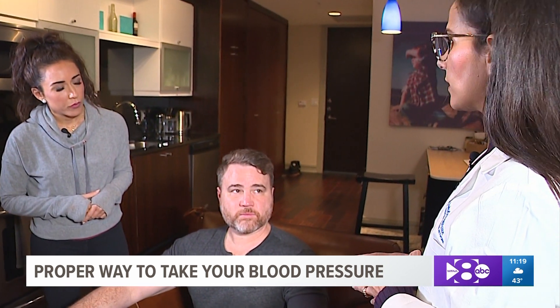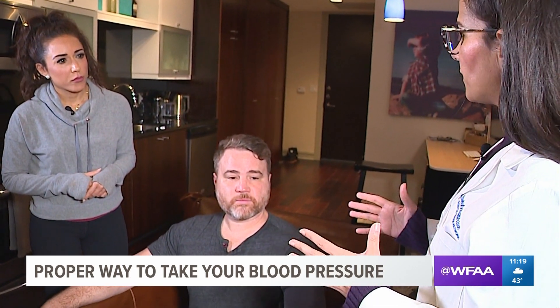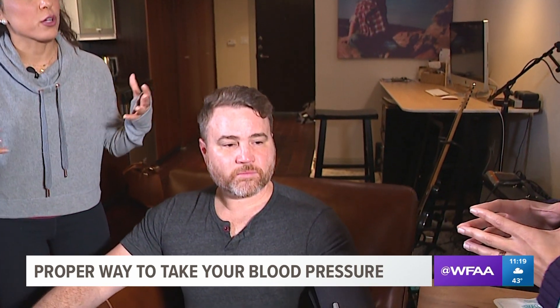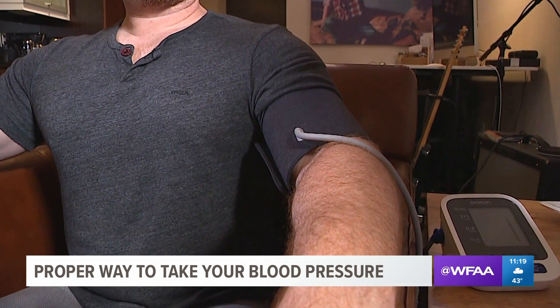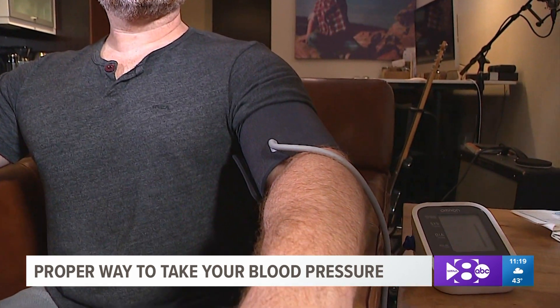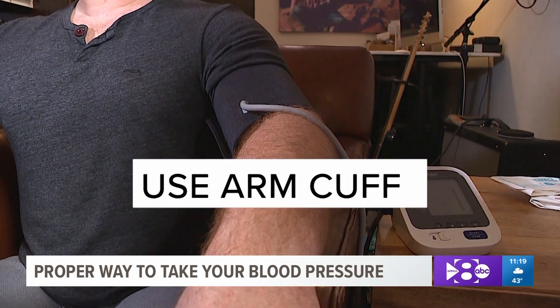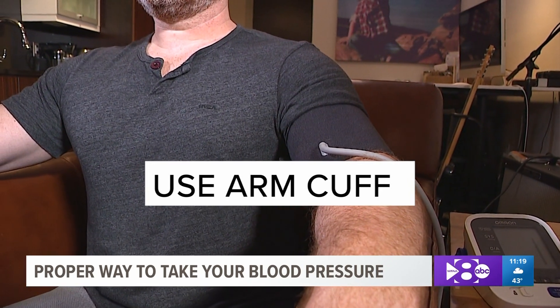The other important thing to remember is the cuff size and the way the cuff fits on your arm. There are various cuff sizes for different people — if you're a bigger person, you need a bigger cuff; smaller person, a smaller cuff. The American Heart Association recommends the arm cuff as compared to the wrist cuff.